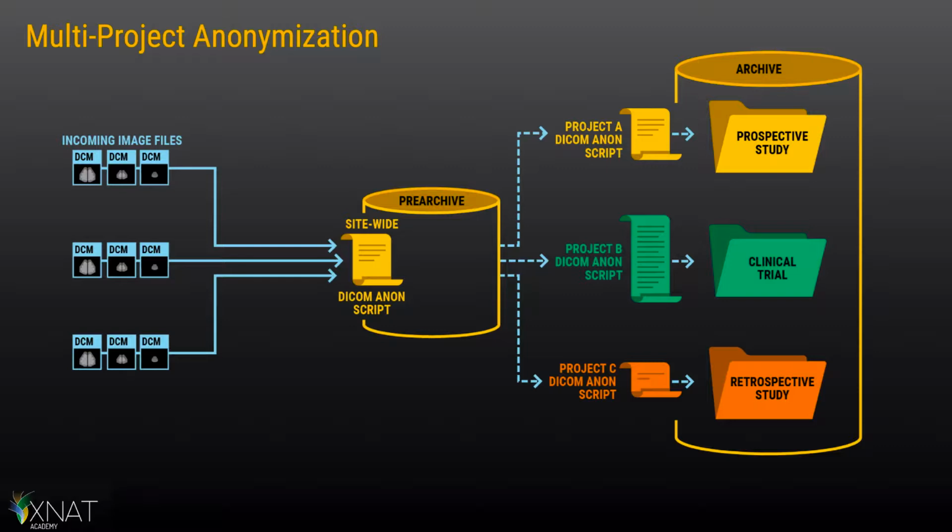Typically, your site-wide anonymization script applies minimal changes to avoid sanitizing or overwriting data that might be valuable in a given project. Since each project or each scan site on a multi-site project might have different looking DICOM data, it's incumbent on each project owner or study coordinator to develop a DICOM anonymization script that works for their incoming data. And if you're administering an institutional XNAT that supports many types of projects with wildly varying anonymization needs, you might want to disable site-wide anonymization altogether and rely on each project to set their own anon scripts.